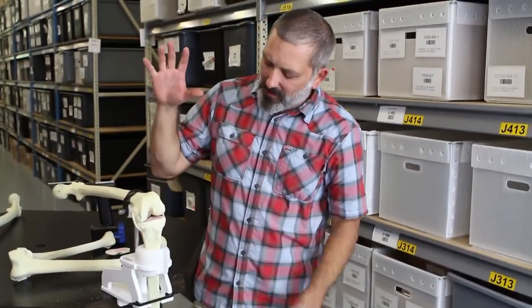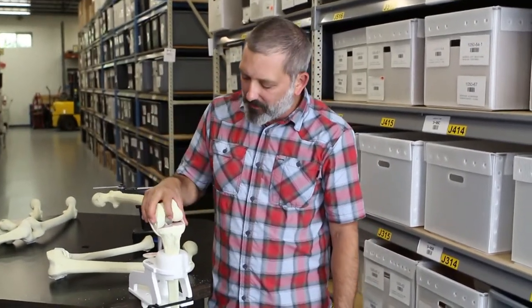So again, this is our Sawbones Express Knee Holder, part number 1600-6. It's been a real popular item for us. We've had a lot of great feedback from the field. I hope you like it.